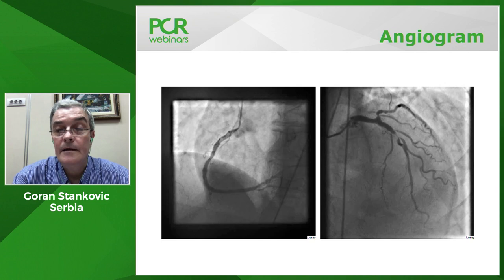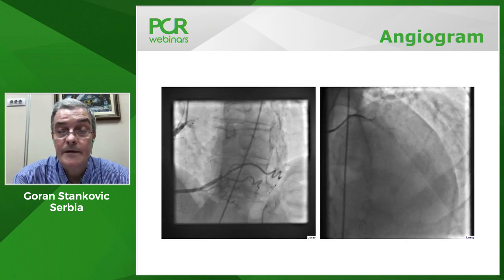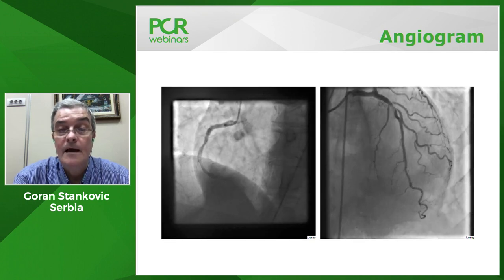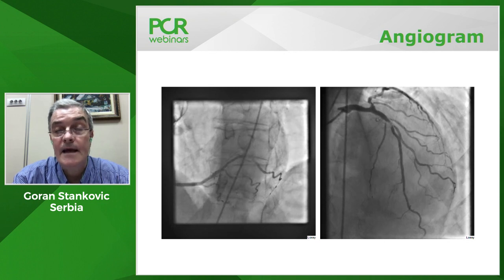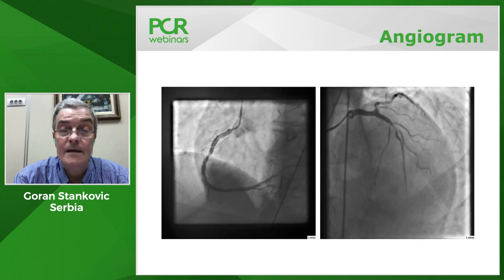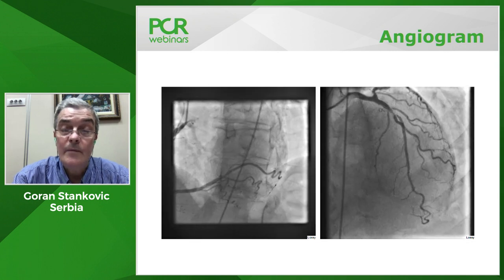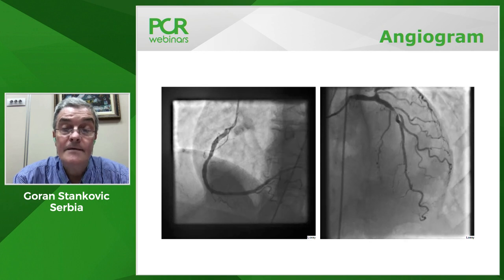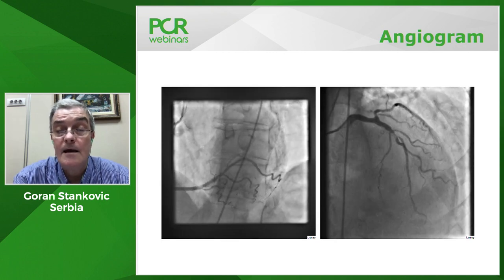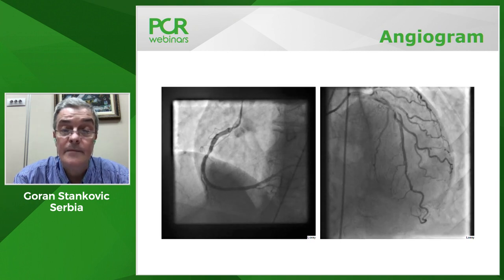In every cath lab, we frequently see cases like this one with large plaque burden, with significant stenosis in both proximal and distal segment of the main vessel, as well as in the ostium of a relevant side branch. So the main question is, what is the risk of losing the territory of the side branch, and how to prevent that? When we speak about provisional for the European Bifurcation Club, it is a strategy and makes a difference compared to technique. For example, when we say DK crush, it's a technique of two-stent strategy, starting with the side branch stenting first and then stenting the main vessel.